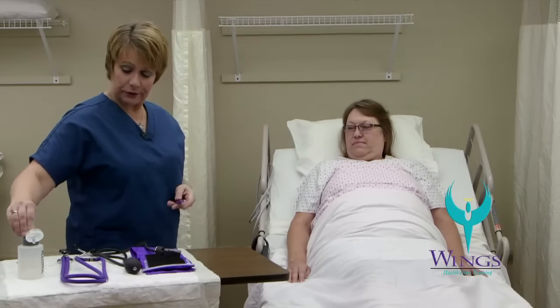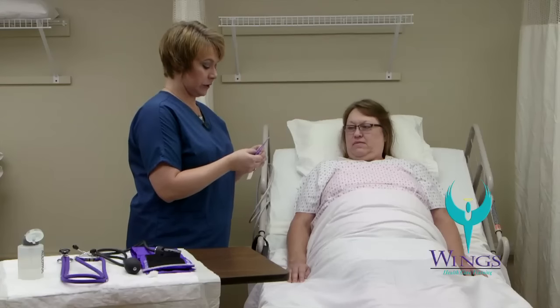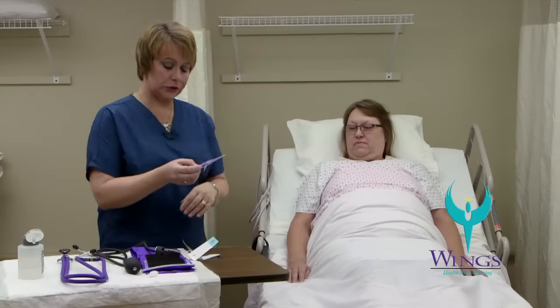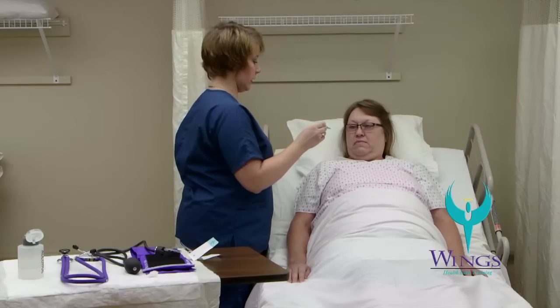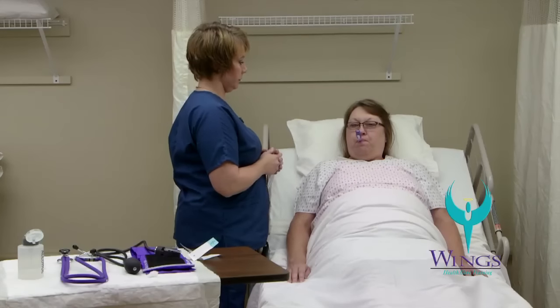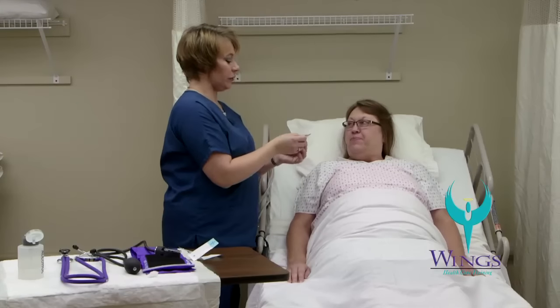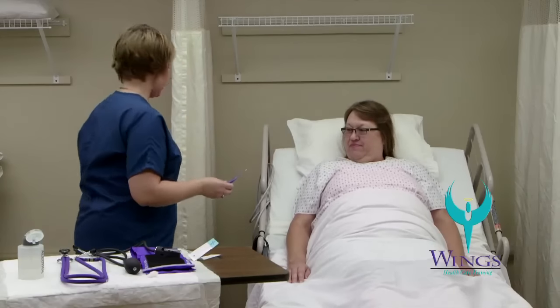First, I'm going to check your temperature. I'm going to clean the thermometer with a small amount of alcohol in a cotton ball. The thermometer goes in the plastic sheath between the two plastic pieces. I'm going to turn the thermometer on and wait for it to say it's ready. The thermometer goes under the tongue and in the back of the mouth. Your temperature is 98.6, Beth. I'll take the thermometer sheath off and place it in the trash can.